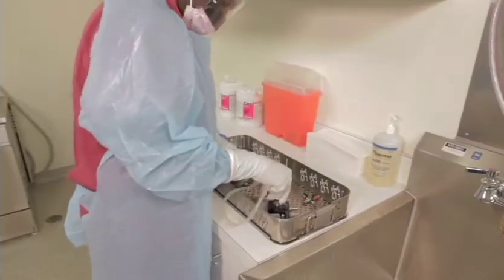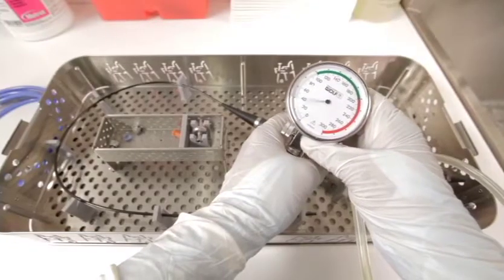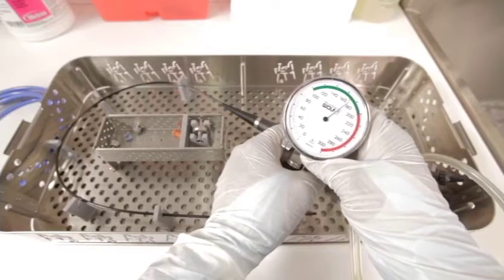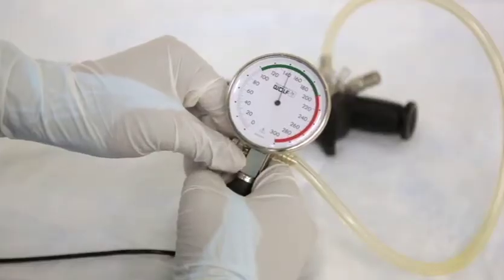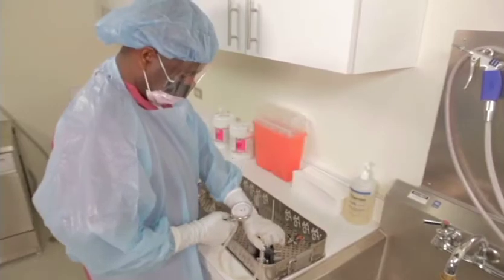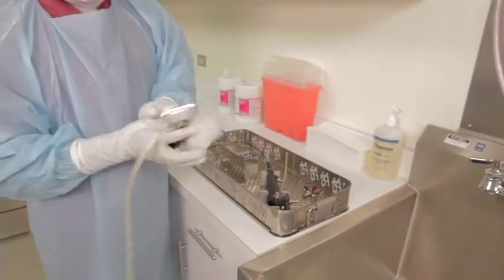To perform a leakage test, connect the locking collar of the leakage tester tube onto the scope's pressure equalization connector. Close the knurled screw on the leakage tester. Inflate air into the endoscope using the rubber bulb until the needle is in the green range — 100 to 200 millimeters of mercury. Wait 30 seconds; if there is no drop of the needle from the green zone, the scope is safe to reprocess. Release the pressure by opening the knurled screw, wait 20 seconds to ensure all air is out, then remove the leakage tester. Spray or wipe the pressure gauge and rubber tubing with a surface disinfectant and store for next use.